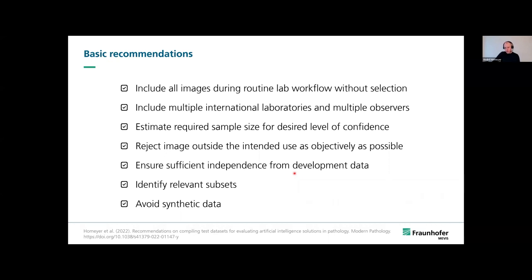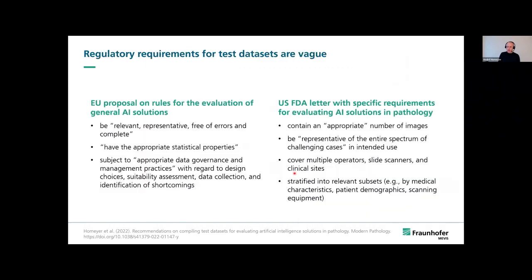And as stated on this slide, the regulatory requirements are very vague. They are more specific in the US than they are in the European Union, and far more advanced as well in the US, especially because of this first cleared product for marketing in 2021. But still, it's really not very helpful if you're a small AI solution developer and you wonder how to conduct your evaluation.